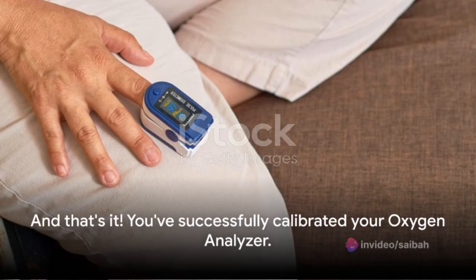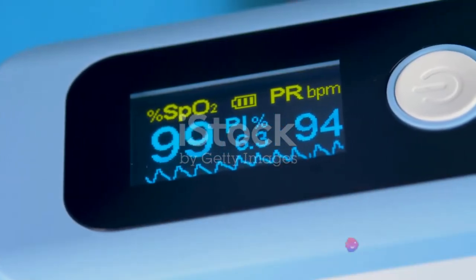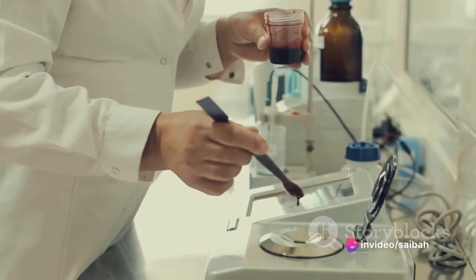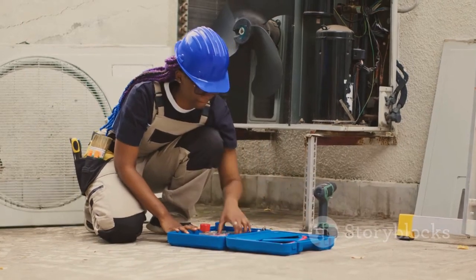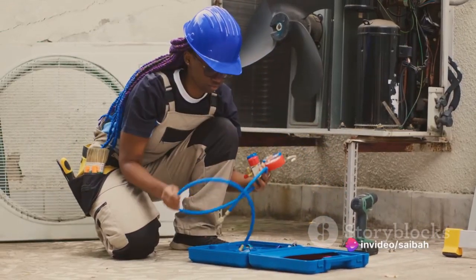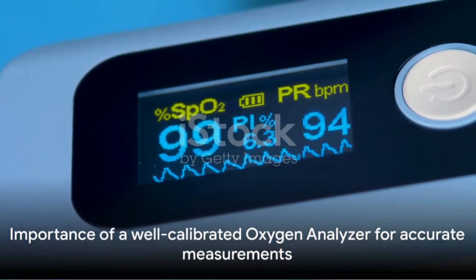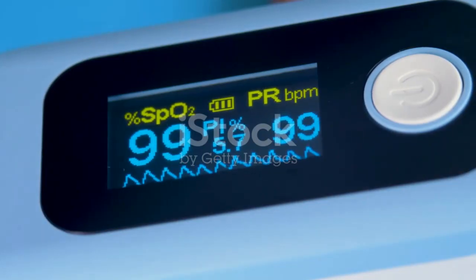And that's it — you've successfully calibrated your oxygen analyzer! We began with understanding the calibration process, followed by a step-by-step guide covering preparing the analyzer, setting the zero and span points, and verifying the calibration. Regular calibration is vital for accurate readings and ensures the reliability of your oxygen analyzer. Remember, a well-calibrated oxygen analyzer is key to accurate and reliable measurements. Happy calibrating!